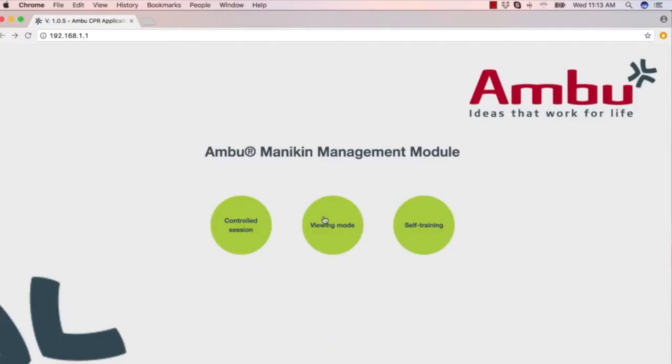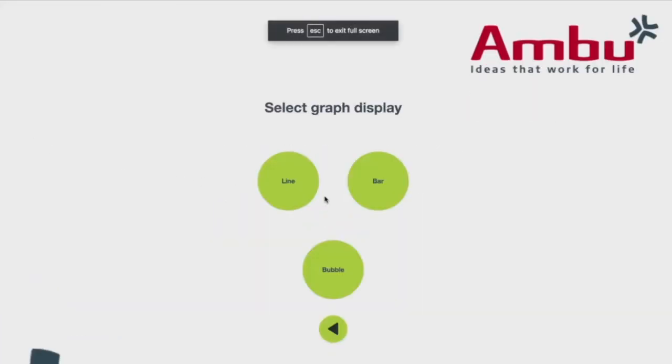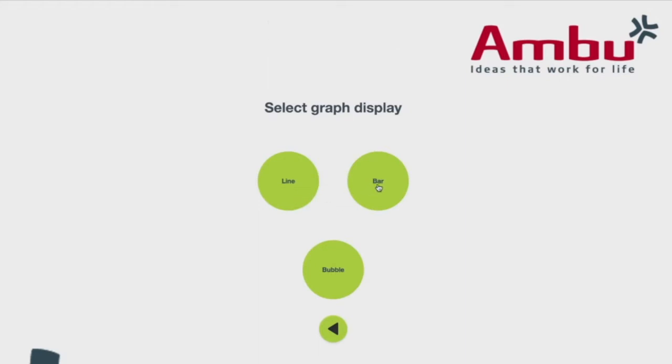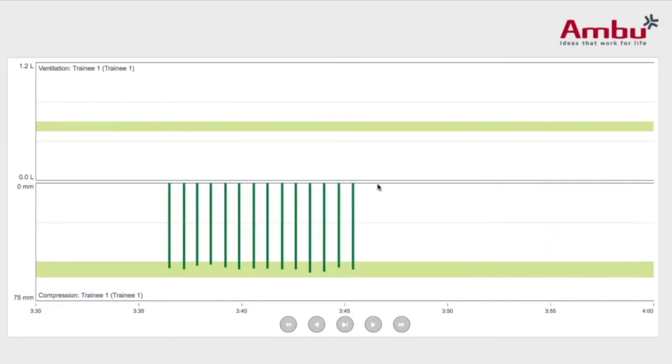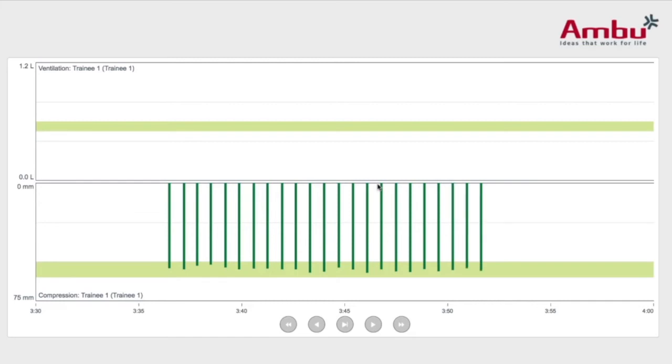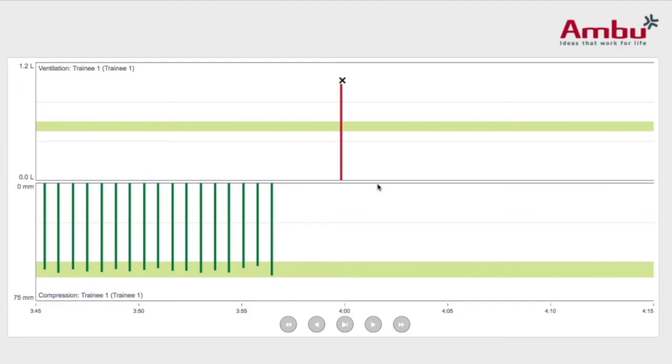In this demonstration, we're going to select the bar graph to illustrate what that will look like during CPR compressions and ventilations. As you can see, you have a straight line. The compressions are getting in the green, and there's no leaning. Then a pause for ventilations. Again, an X for over-ventilating.